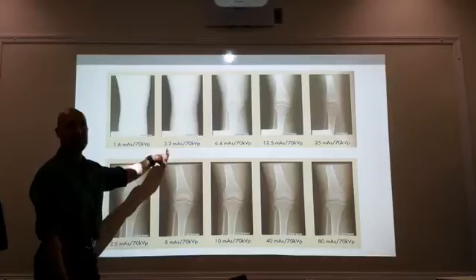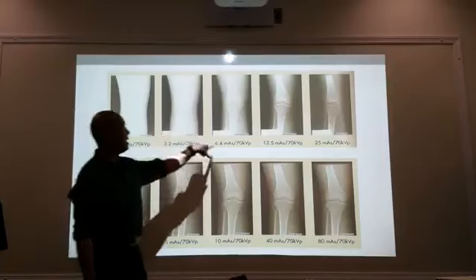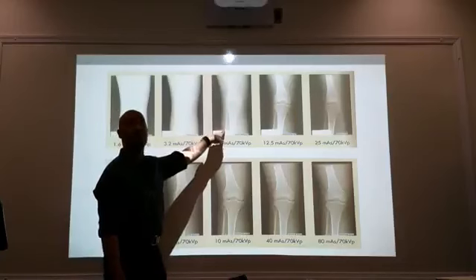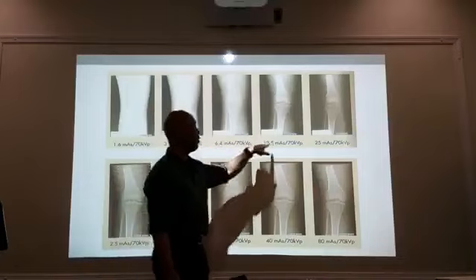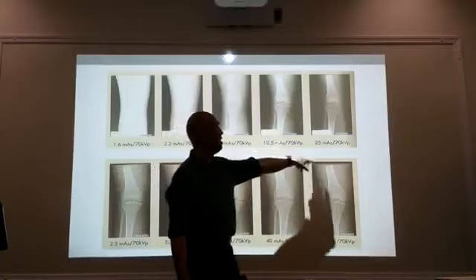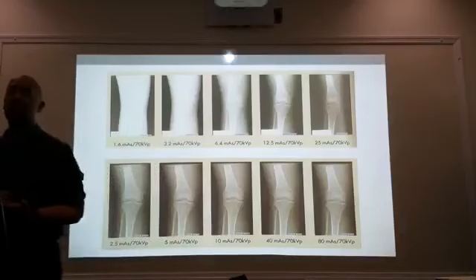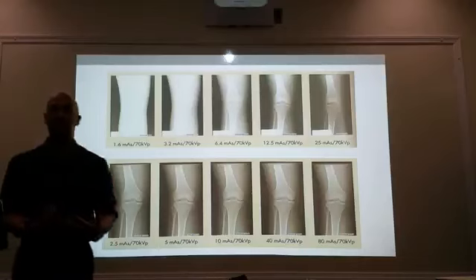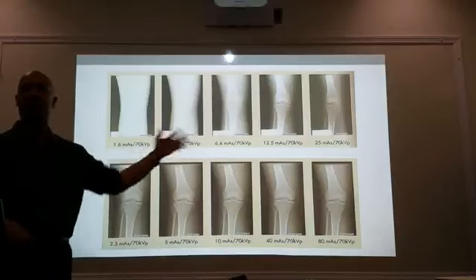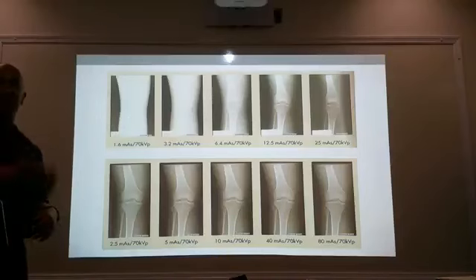We doubled our X-ray exposure. Still light. We doubled it again, 6.4. We're getting there, right? Let's do it again. Now we're going from 6.4 to 12.5. Looks pretty good. At 25, it looks even better. But with film, again, you were able to assess the patient exposure by also looking at the exposure of your film. Your film was the telltale of your patient exposure.